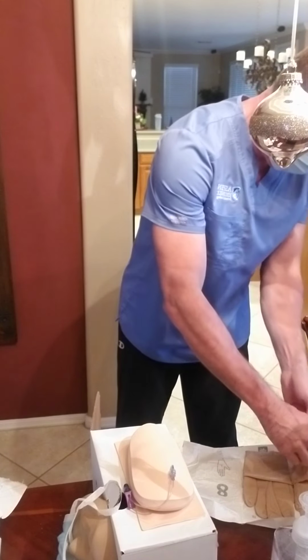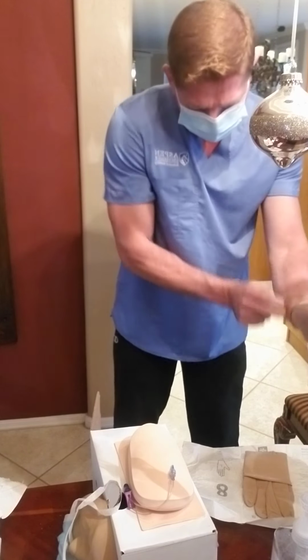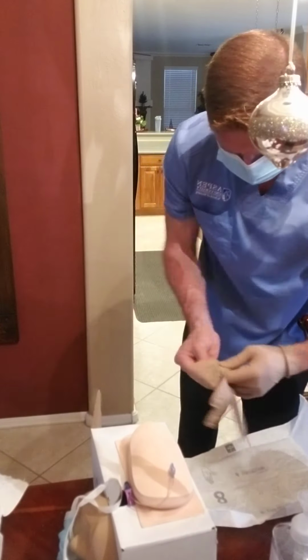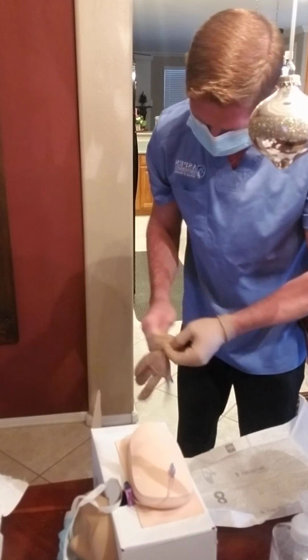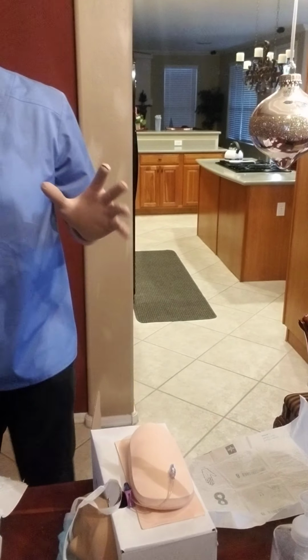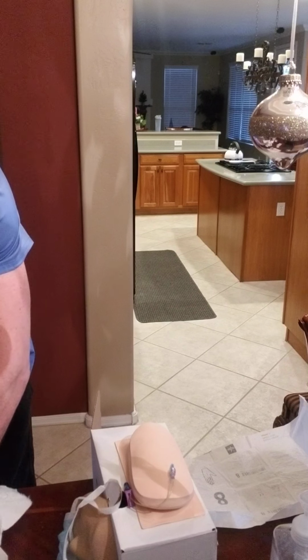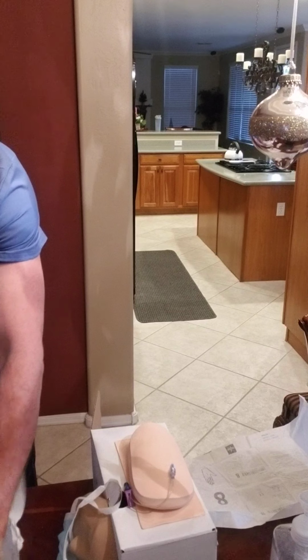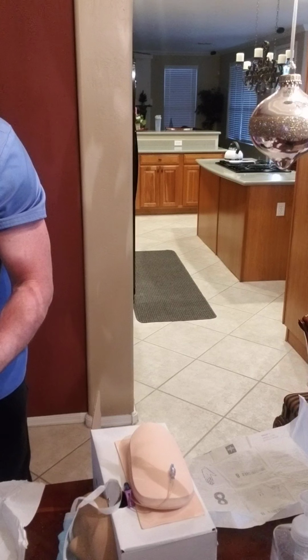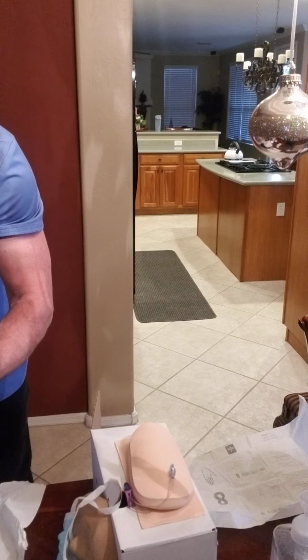So I'm gonna grab this, put the first one on my dominant hand, then this will go on my non-dominant hand. Okay. There's that. So now I'm going to prep my stuff here, and skin protected.